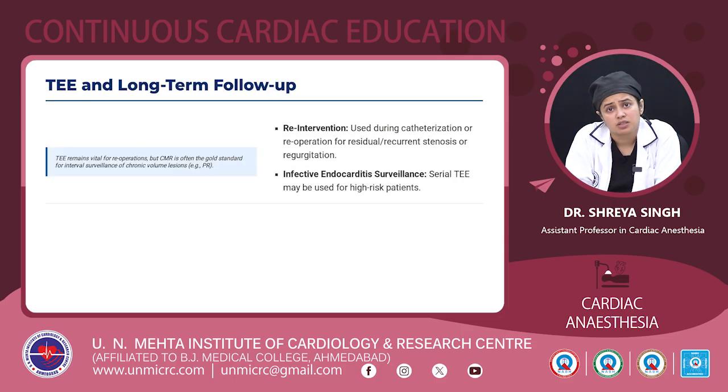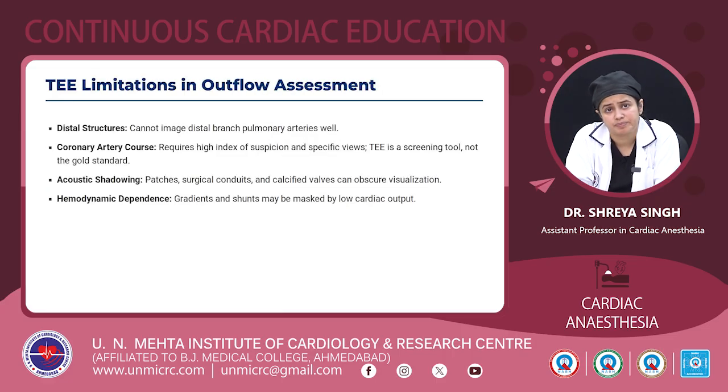Talking about TEE and long-term follow-up, it can be used in re-intervention. It is used during catheterization or reoperation for residual or recurrent stenosis or regurgitation. And we can do serial TEE for high-risk patients, especially for infective endocarditis surveillance.